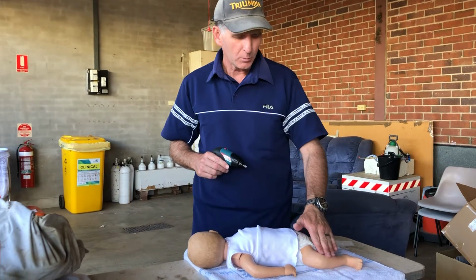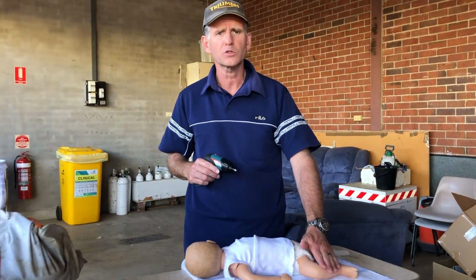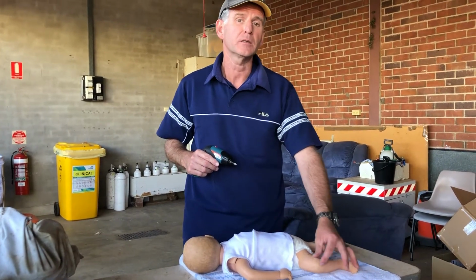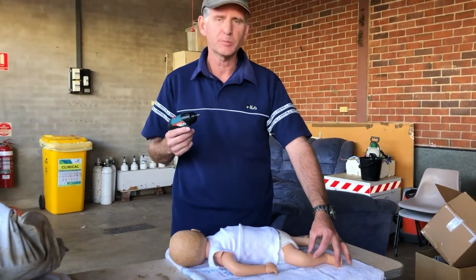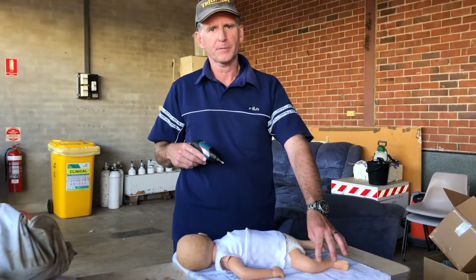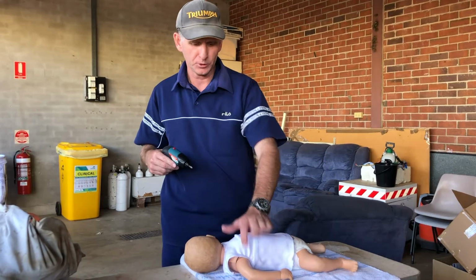Just quickly, we need to see if there are any contraindications for intraosseous, and those include an infection over the site, a wound over the site we want to use, such as a burn, whether that bone has had an intraosseous needle in it before and the cortex of the bone has been exposed in the last 48 hours, whether there's a fracture in that bone, or whether there's another intraosseous needle already in that bone, in which case we'd have to go to the other leg, or we could use the top of the humerus for this child.